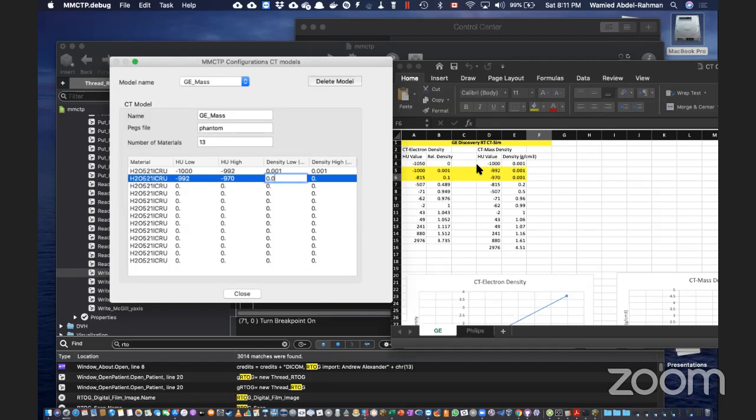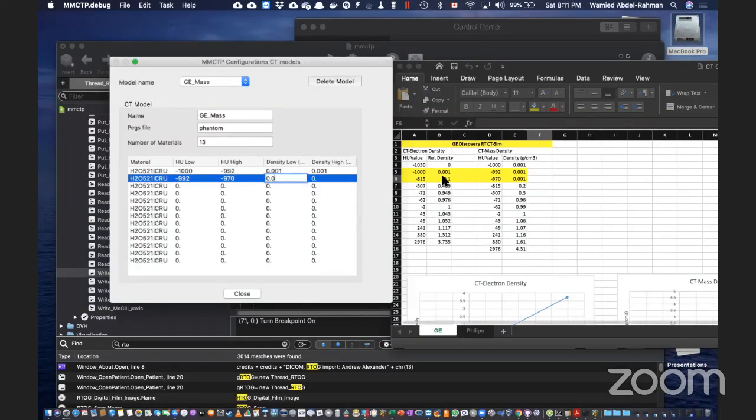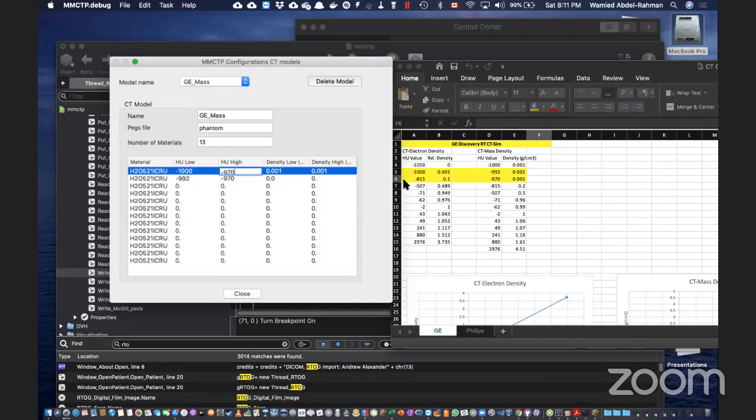I could actually just do it as one single entry. Or this is probably a typo I have. I'm not sure, because here that's correct. See, it's 0.1 and then 0.001. Still the correct density. Okay, so I probably have a typo here. I see now, because this is from minus 815, it's a different value. So instead of this, we can just go from minus 970, because the density is still the same. So I can combine these two in one entry. From minus 970 to minus 815, and this will be 0.001, and then this will be 0.2.